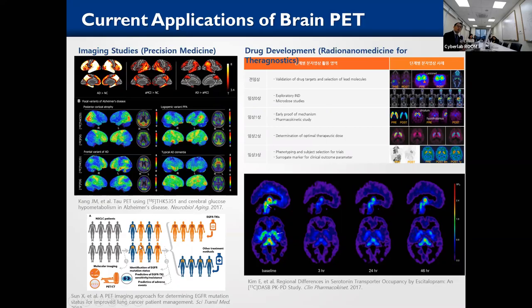We need to assess the absolute quantitativeness of PET images individually, not average groups of people. So we need the absolute receptor amount in individuals to make therapy plans, individually fitted plans or related therapeutic drugs. We need to get the absolute quantity of the receptors and drugs. So in this field, people say tracer kinetic modeling is now more important.